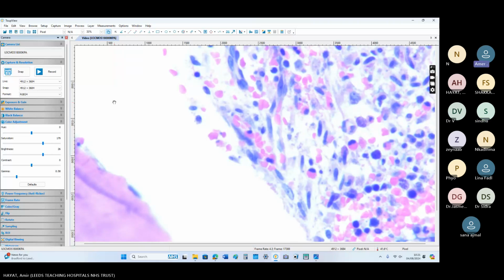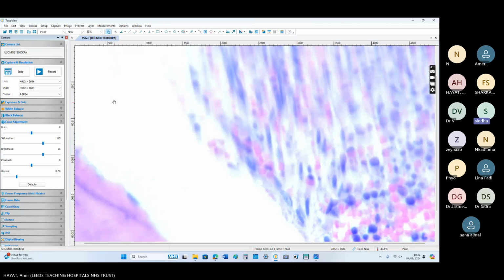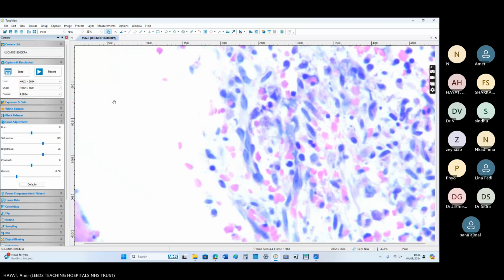So you have low back pain, pancytopenia, organomegaly, and you have a Giemsa stain in the exam. A few lymphoid cells are also present here. These are the diagnostic cells, the spindle-shaped cells.